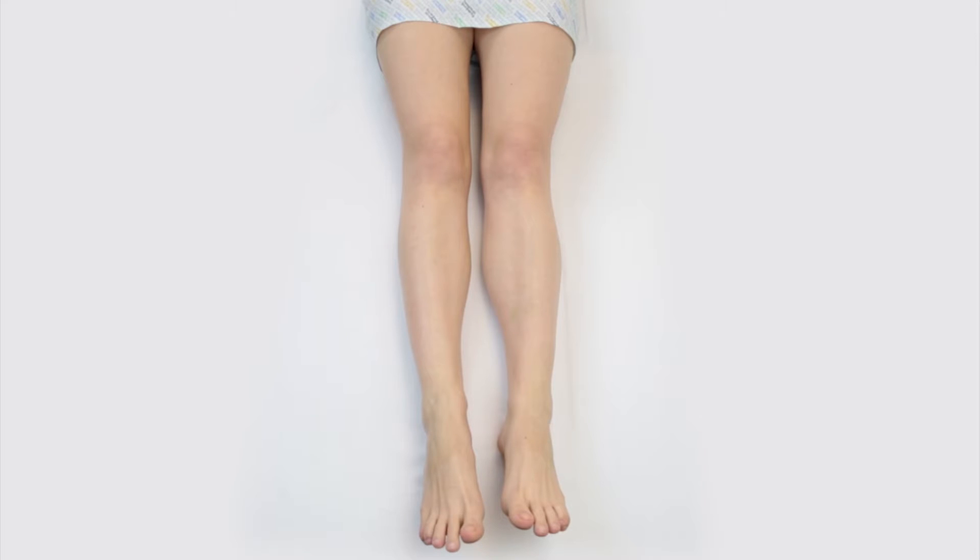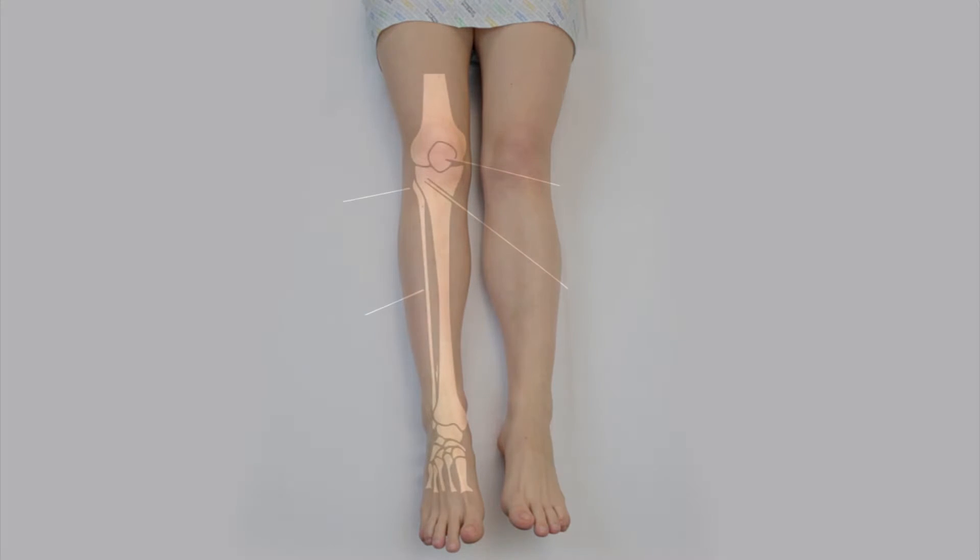Before fitting the device, first find the location where the device is to be secured. It can be found on the outside of the leg, just below the level of the knee, at the centre of the fibular head. The fibular head can be felt as a round protrusion at the very top of the fibular bone.